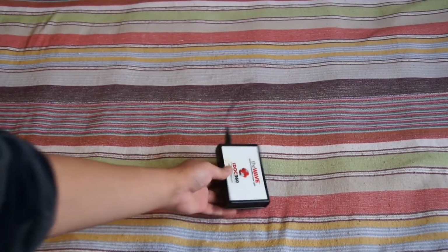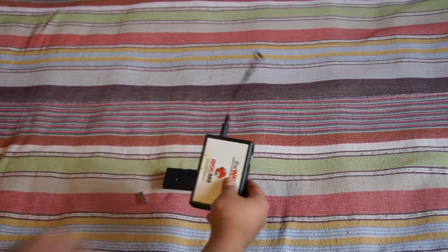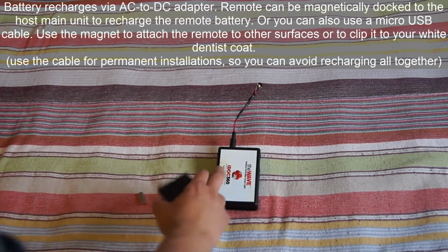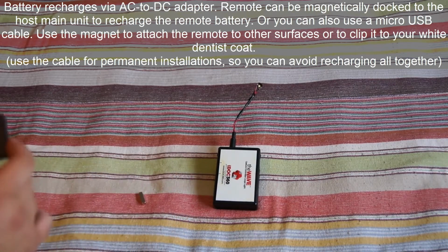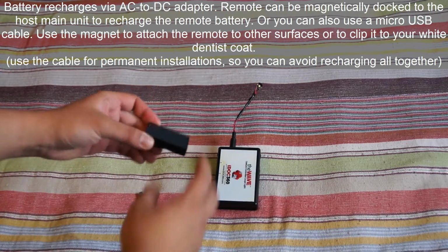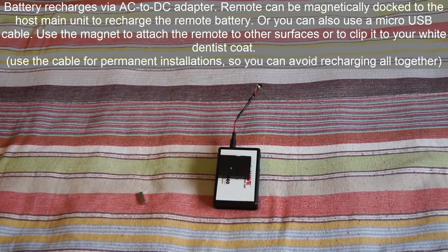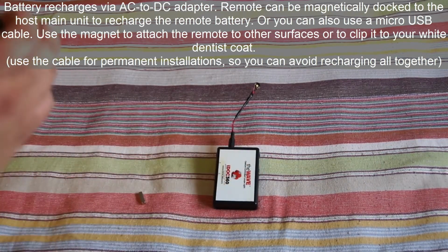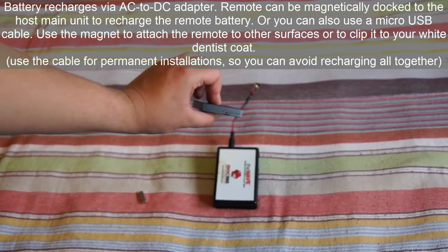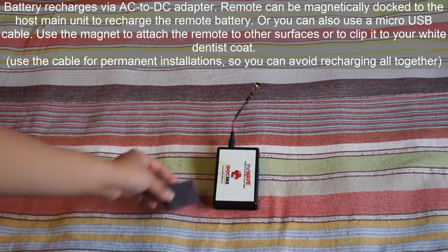Another thing is this main unit. You plug a charger into it to recharge the main unit, and also on the main unit there are two spring-loaded pins. It's a dock, and the remote has charging contacts, and it's also magnetic. So just to recharge it, you just do that. You have to plug in the charger too. If you don't want to do that, there's also a micro USB cable connector here to do the recharging if you prefer that instead.